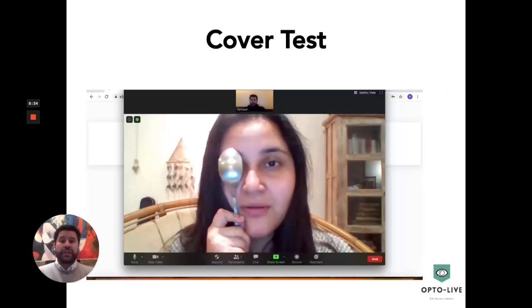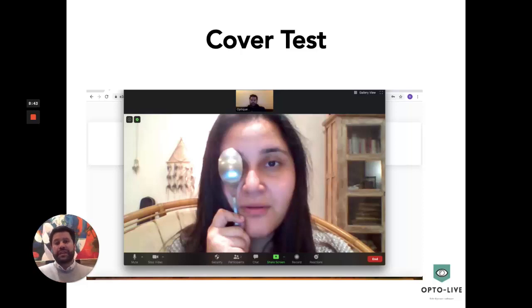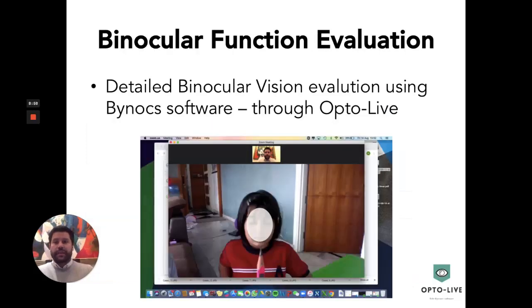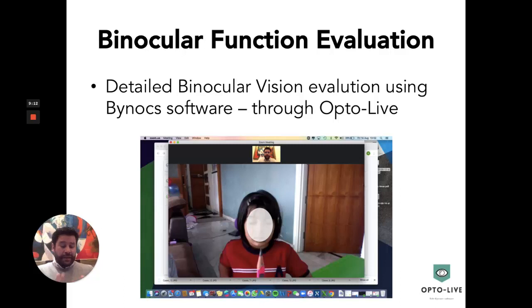Another test that can be done is the cover test and alternating cover test. We usually suggest someone else in the house helps, but patients can also do it themselves, and we can look for any phorias and tropias. We ask the patient to focus on the camera for near, and also on an object about ten feet away, to see if any phoria or tropia is present. For a detailed binocular function evaluation, we use Binox software which is available through Optolive, to evaluate any binocular vision dysfunction.